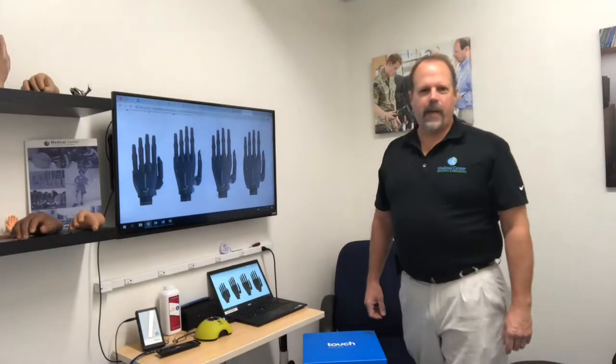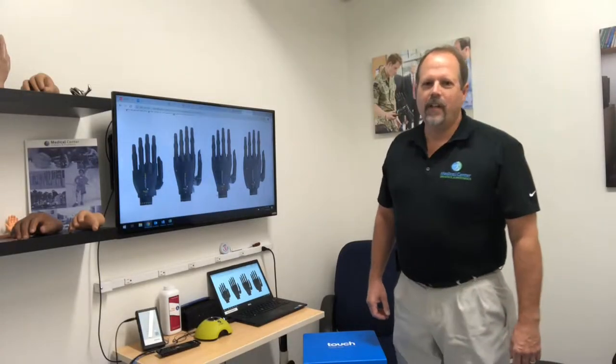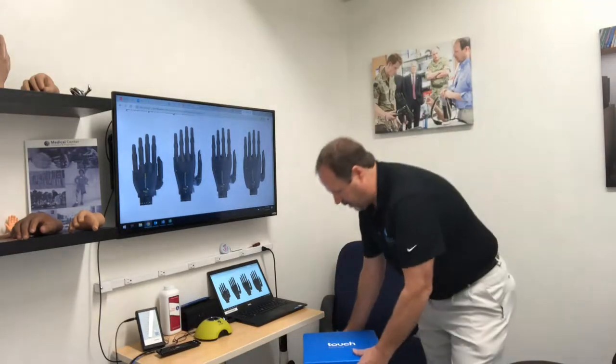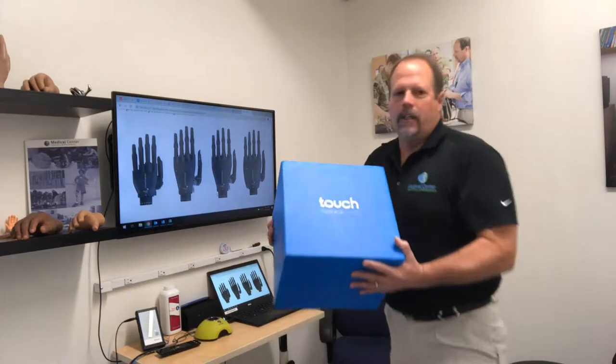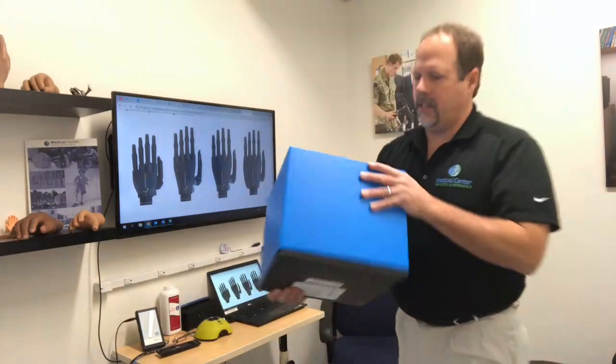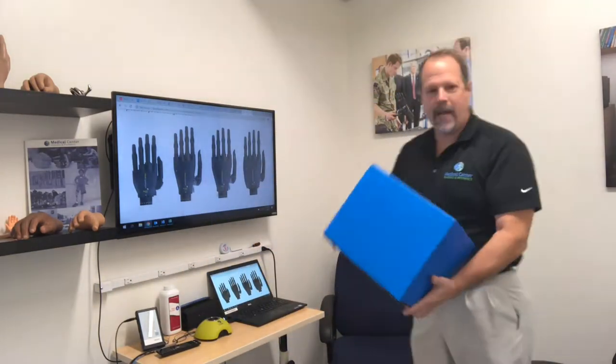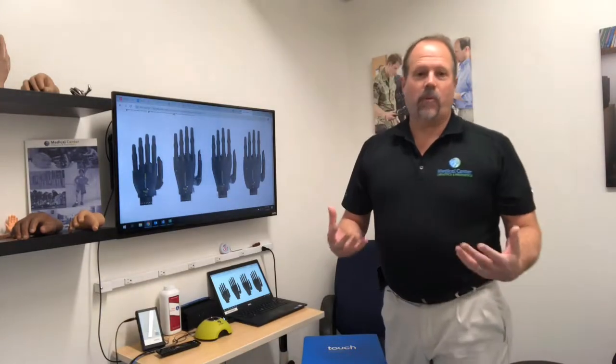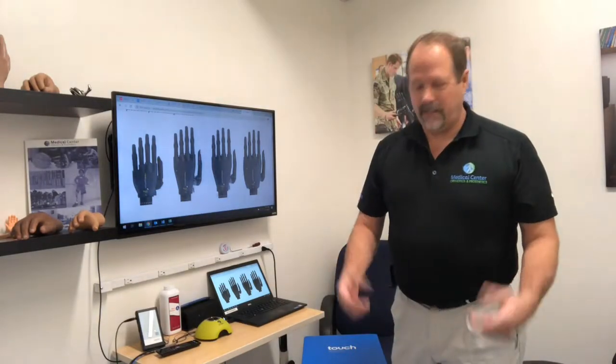Hello, my name is James Vandercy with Medical Center Orthotics and Prosthetics. Today I'd like to introduce you to a nice new product. This is from our friends at Touch Bionics. It's a nice blue box here that has come in. The packaging is great on this device, and the device itself has some great attributes that I'd like to introduce you to today.